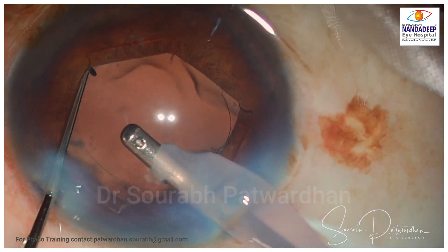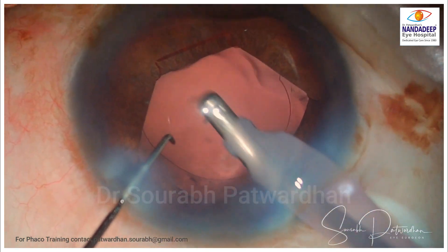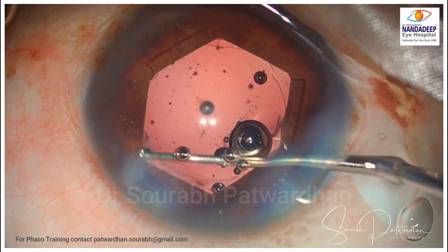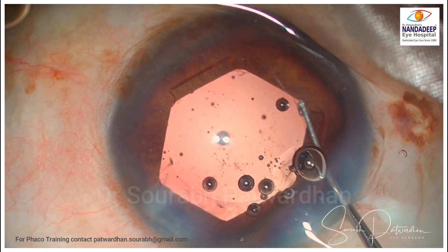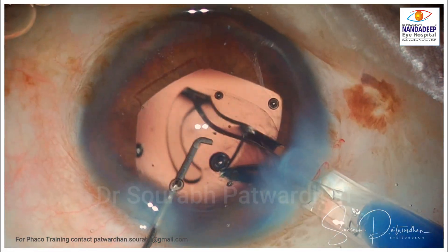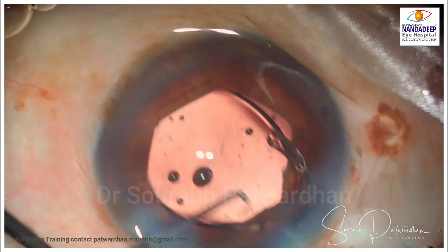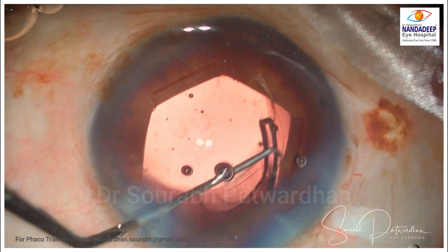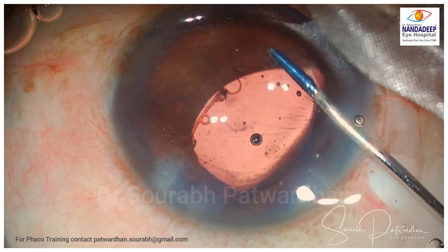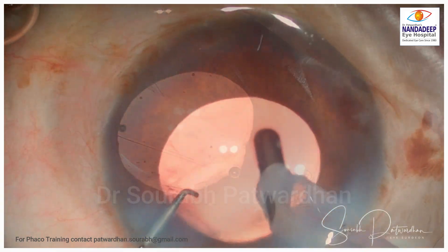You can retract the B-hex and check for any residual cortex. It is better to use a Couglan hook to retract the iris all around. Be watchful for any retained cortex and remove it before putting the IOL if possible. While injecting the IOL, just make sure that the trailing haptic doesn't get engaged in any of the flanges of the B-hex, otherwise the B-hex may get entangled from the iris and go under the iris. Just be careful about that.